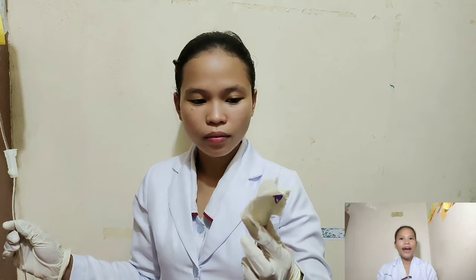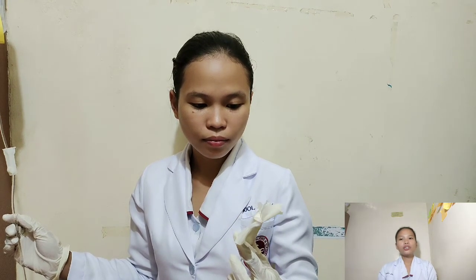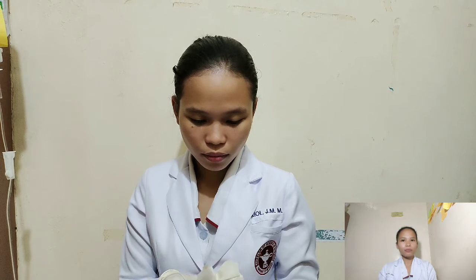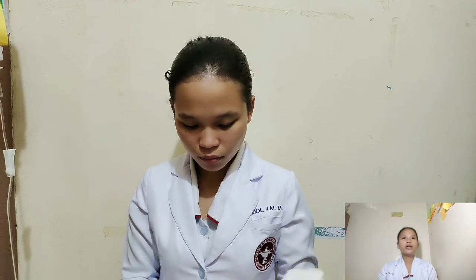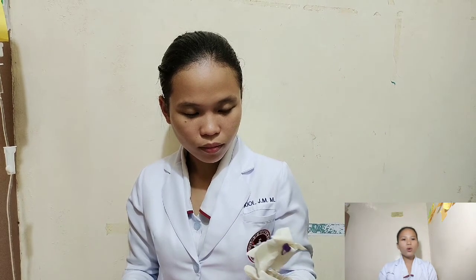Check the needle or catheter to make sure it is intact. Report a broken needle or catheter to the nurse in charge immediately. If the broken piece can be palpated, apply a tourniquet above the insertion site. If a piece of needle or tubing remains in the client's vein, it could move centrally toward the heart or lungs and cause serious problems. Application of the tourniquet decreases the possibility of the piece moving until a physician is notified.